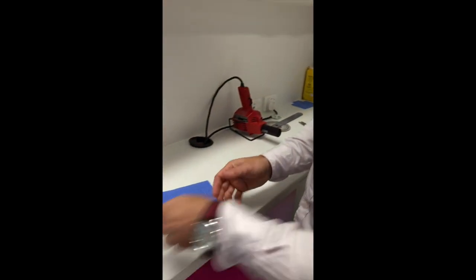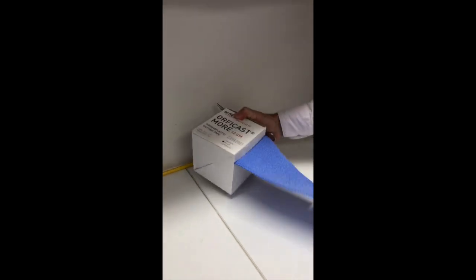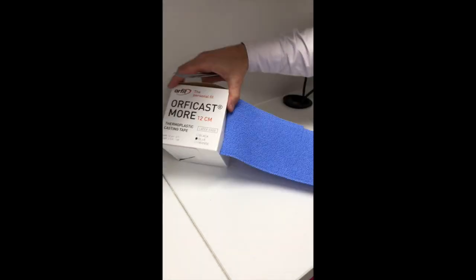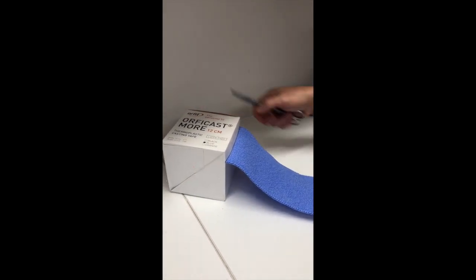Hi, I'm Damien from Advanced Therapy Solutions. Today I'm going to show you a new thermoplastic material that we're using here at Advanced. This product is called Orficast — specifically Orficast More, which is a product that's double the size of its predecessor.